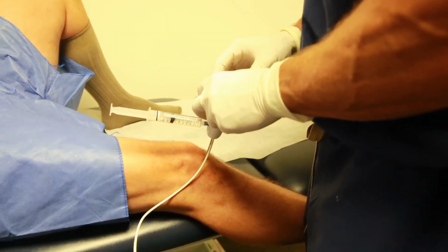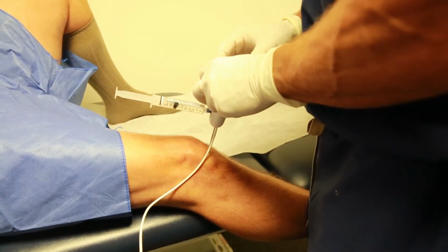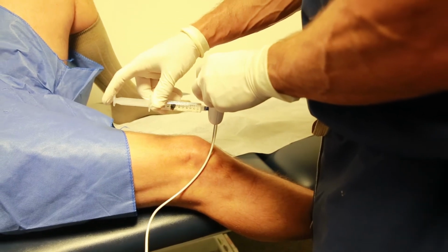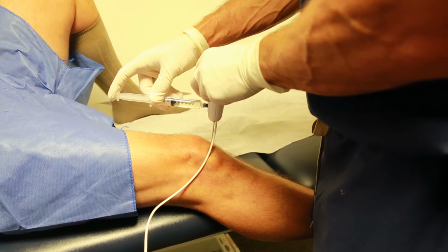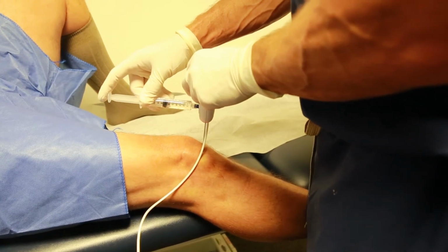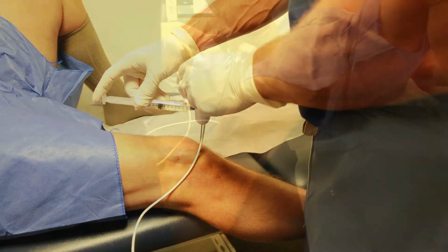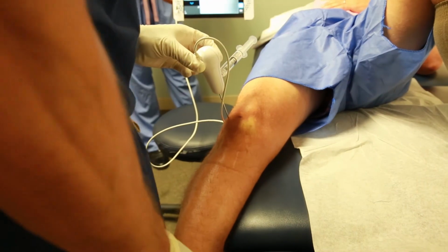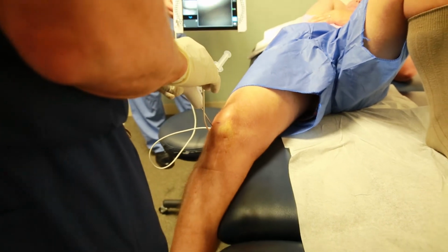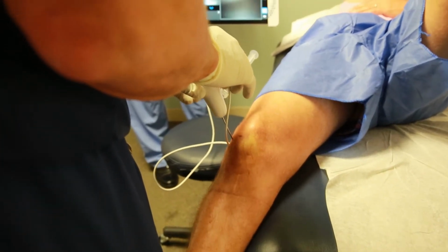And take your time when you get here. Little movements will allow you to see things better. And we're getting his lateral compartment. So we're in your lateral compartment now, Jason. Okay. Your condyle looks pretty good. I'm going to bend your knee a little more. Crank that open. Now I'm in your lateral compartment.